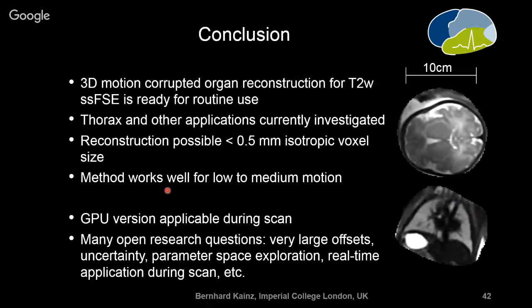So in summary, it works currently quite well. We have it distributed all over the world. People are quite happy with what they can do at the moment. Bioengineers are happy with the tools you give them, and they just throw in their data and something useful and nice comes out by just a small command line. But it's a command line tool, so it's not very, very fancy.